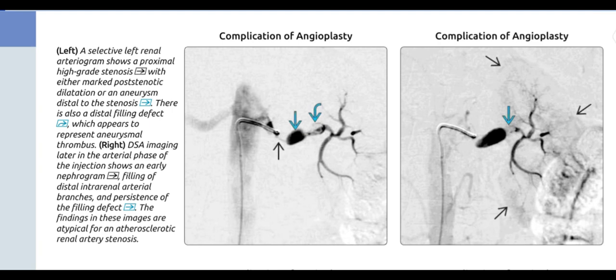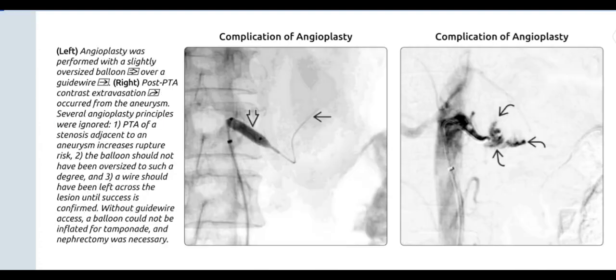A selective left renal arteriogram shows a proximal high-grade stenosis with either marked post-stenotic dilatation or an aneurysm distal to the stenosis, and also a distal filling defect appearing to represent aneurysmal thrombus. DSA imaging later in the arterial phase shows an early nephrogram, filling of distal intrarenal arterial branches, and persistence of the filling defect — findings atypical for atherosclerotic renal artery stenosis. Angioplasty was performed with a slightly oversized balloon over a guidewire; post-PTA contrast extravasation occurred from the aneurysm. Several angioplasty principles were ignored: PTA of a stenosis adjacent to an aneurysm increases rupture risk; the balloon should not have been oversized to such a degree; and a wire should have been left across the lesion until success is confirmed. Without guidewire access, a balloon could not be inflated for tamponade, and nephrectomy was necessary.